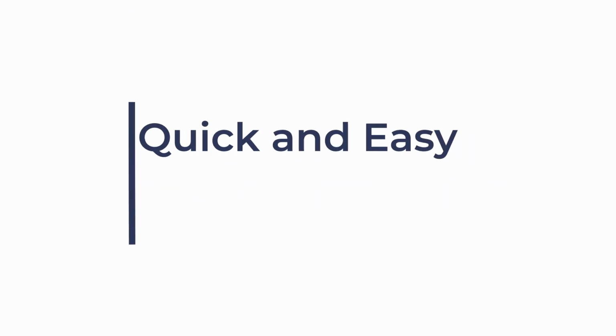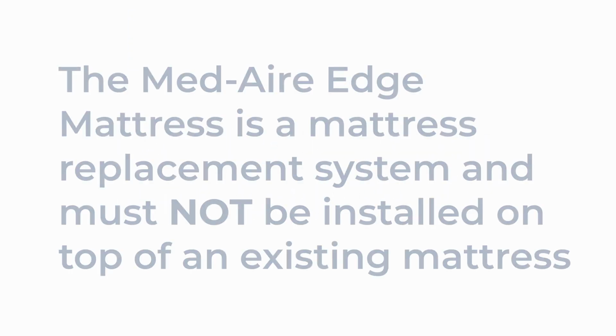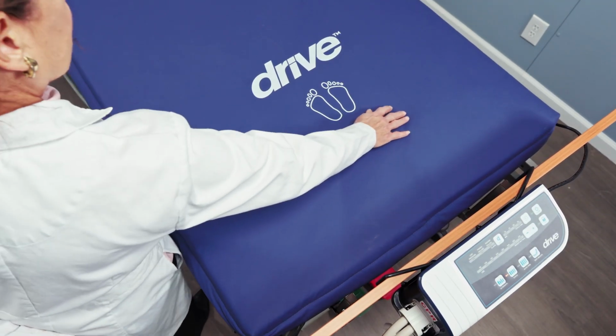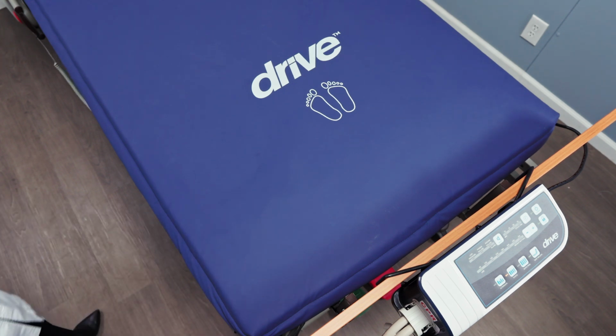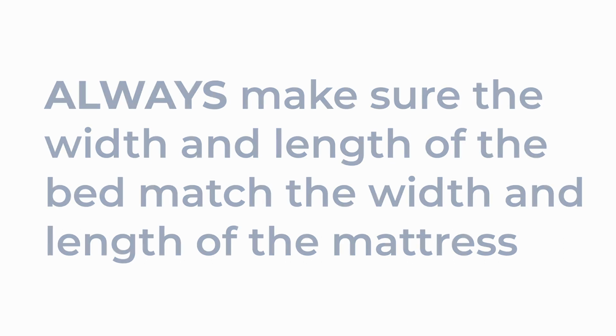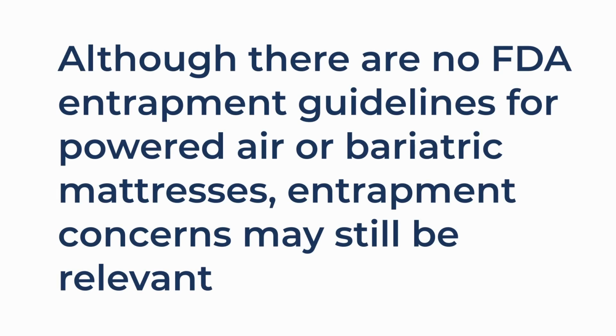It's quick and easy and no tools are needed. The Preserve Tech MedAire Edge mattress is a mattress replacement system and must not be installed on top of an existing mattress. First, place the mattress on top of the bed frame, noting the Preserve Tech MedAire Edge foot end. Please always make sure the width and length of the bed match the width and length of the mattress, because although there are no FDA entrapment guidelines for powered air or bariatric mattresses, entrapment concerns may still be relevant.